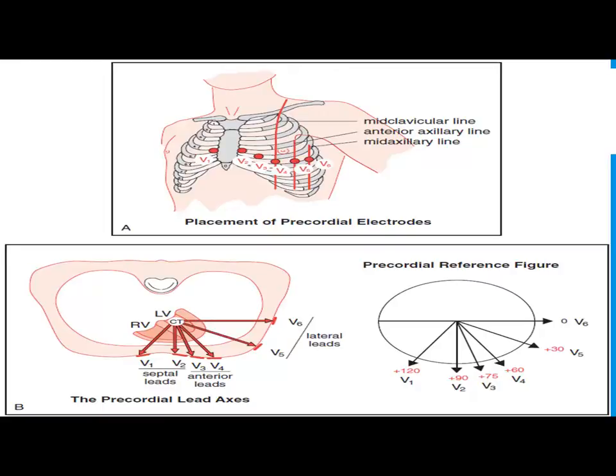You know they're going to be secure. Don't put it over on top of it. The less that voltage has to travel through to get to that electrode, the better. Adipose tissue is not a good conductor of electrical signals, so you want to try to have it as close to the heart as possible. Okay?